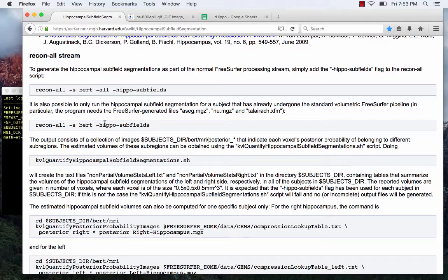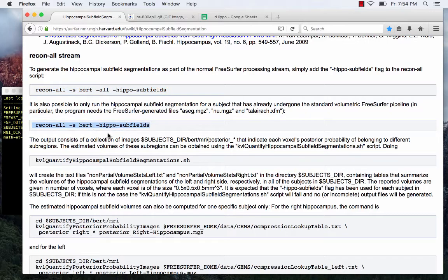To actually get started doing hippocampal subfield segmentation, the next question you have to answer is: have I already done recon-all? Yes or no — because there are two different codes. For me, I've been going back to subjects that already have subject folders and have already gone through the recon-all stream. If you're starting fresh, you can add the hippocampal subfields tag to the recon-all command and it will process everything together — though that will take as long as recon-all does, about a day.